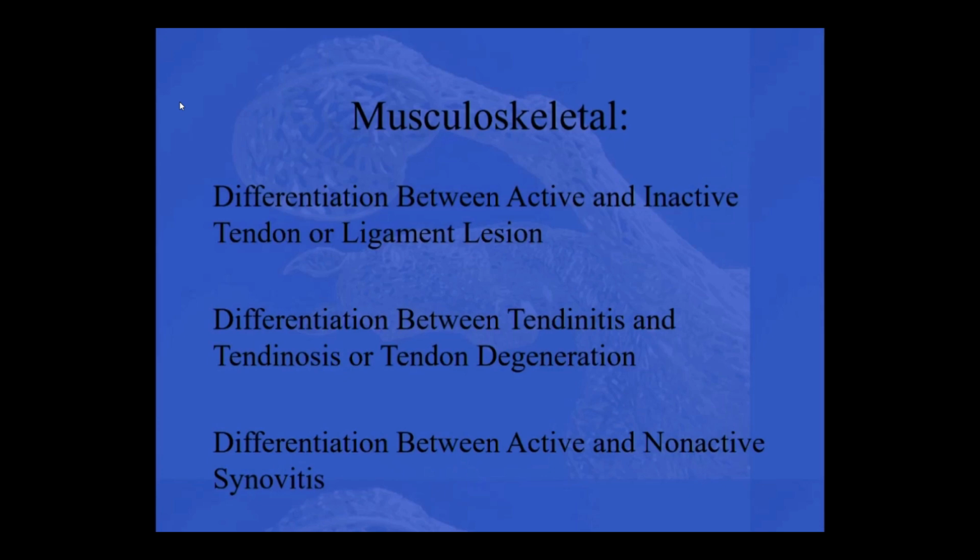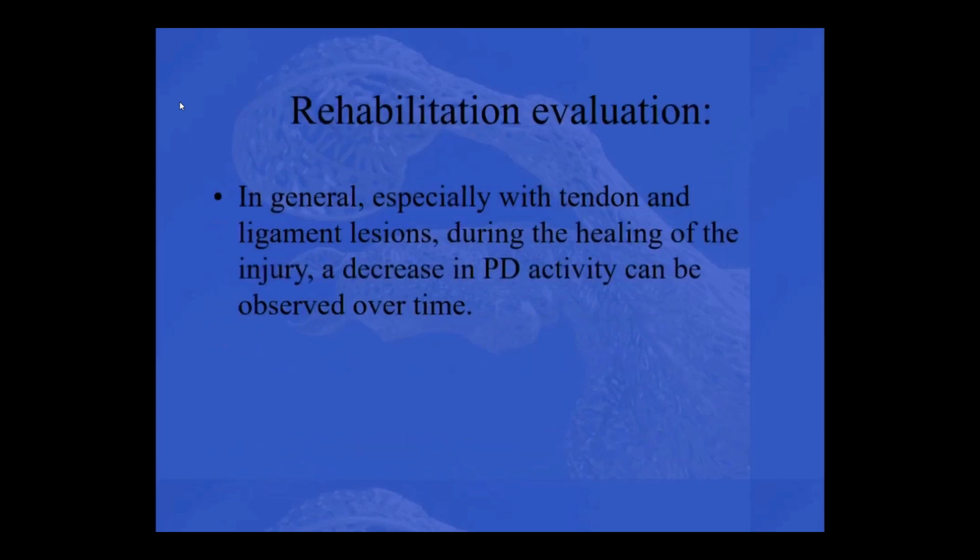They're very well to distinguish with power Doppler, and a differentiation between an active and a non-active synovitis. I'll show you a nice example of a tendon sheath. We all know them, windpuffs, and then the client is really worried if that's an active problem or not. Ultrasound will tell you something, and power Doppler gives you again extra information on how active that process is.